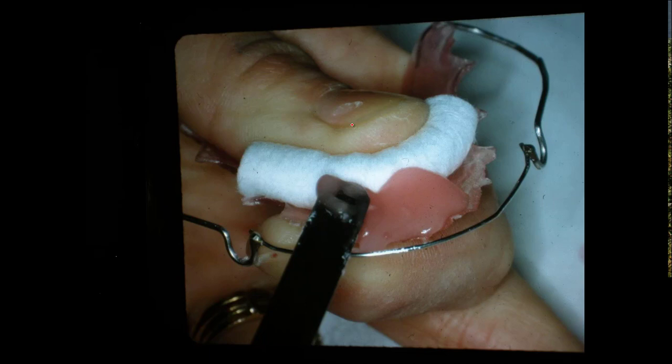You want the retainer that fits — they've been wearing it for a while and it fits up in the mouth real good. Then you put this acrylic on that portion of the retainer right there. This acrylic is mixed up and it runs a little bit, but not much. It's got to be a certain consistency, and the cotton kind of absorbs a little bit of the liquid. You put it on there with your spatula and it's going to fill in this area right here of the retainer.